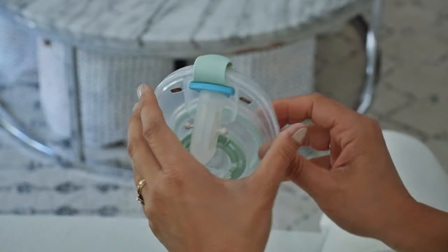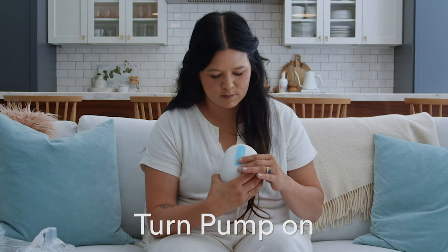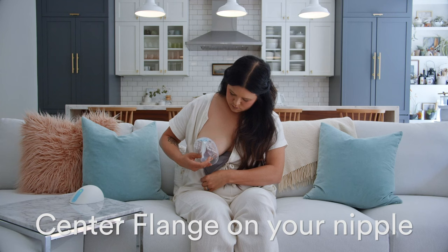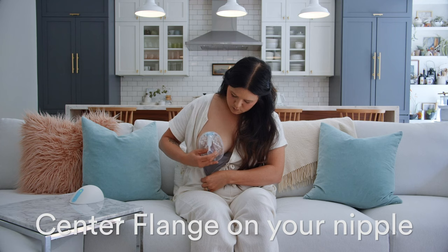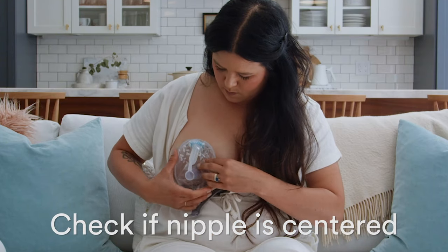If you're pumping with the container, make sure the dial is set to 1, then turn your pump on. Stimulate your nipple and line the flange or container up with your nipple. Look to make sure that your nipple is centered in the flange or insert tunnel.